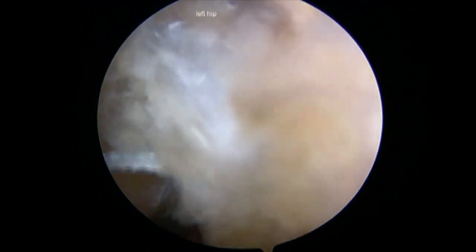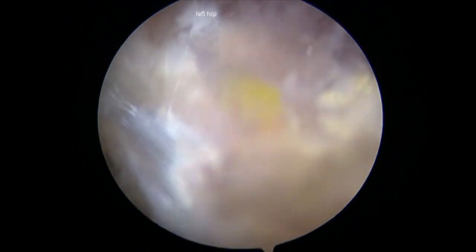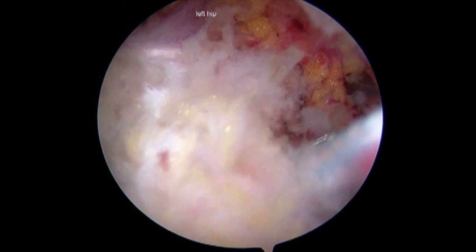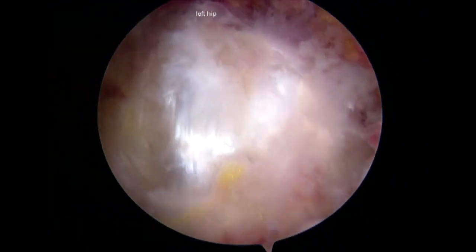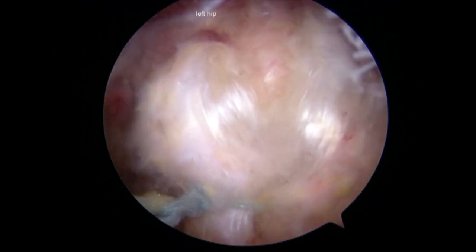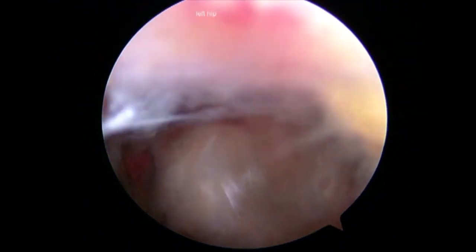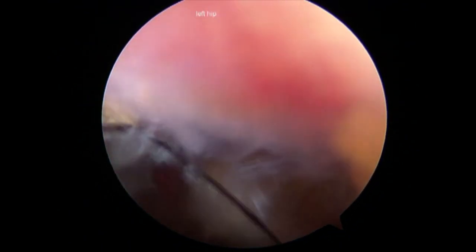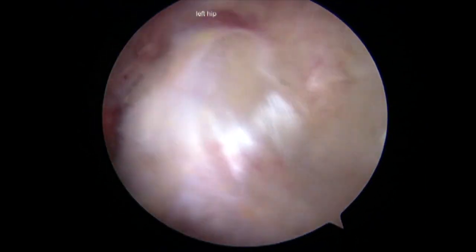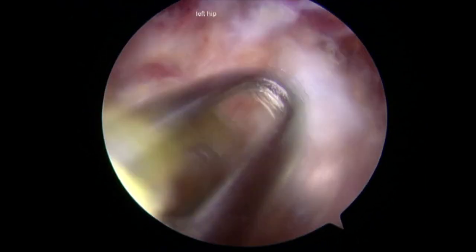The sciatic nerve may be identified lateral to the ischium in the abducted position if there is concern for decompression and need for neurolysis. Protection of the nerve is necessary for every case. Abduction of the operative limb can help protect the nerve. Additionally, if the nerve must be identified, adequate hemostasis must be achieved through electrocautery or epinephrine in the fluid.